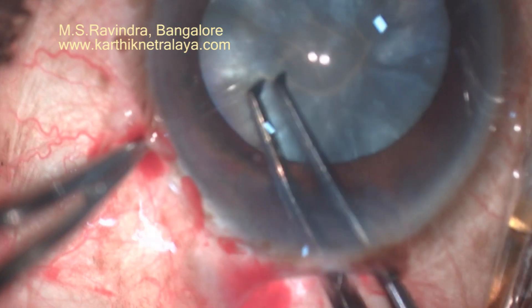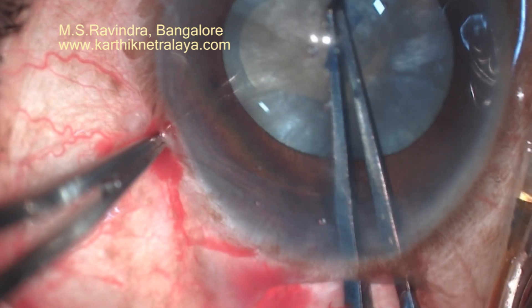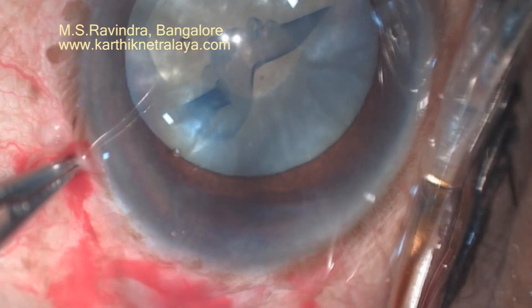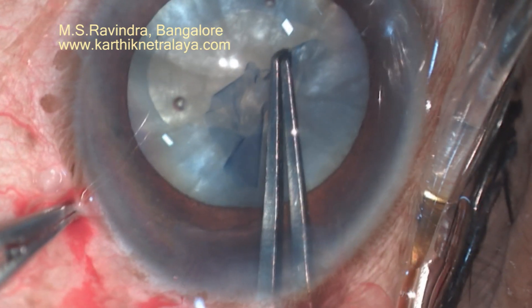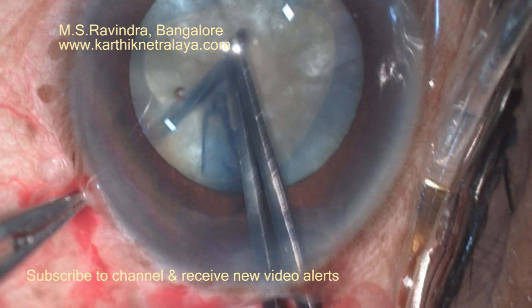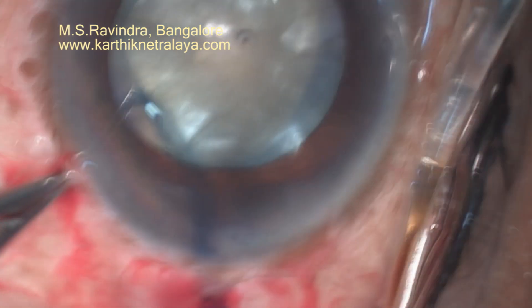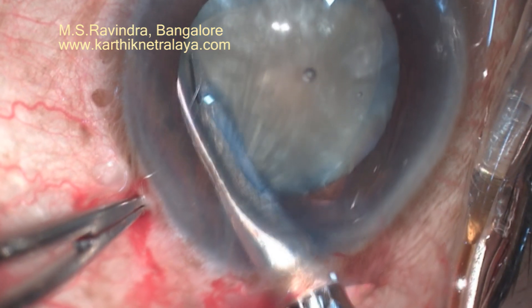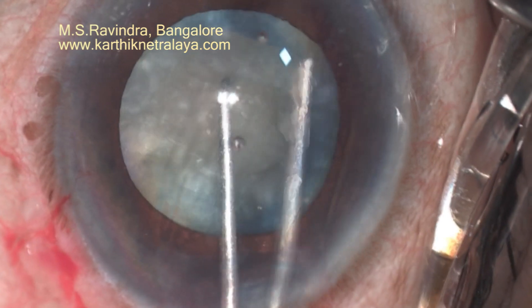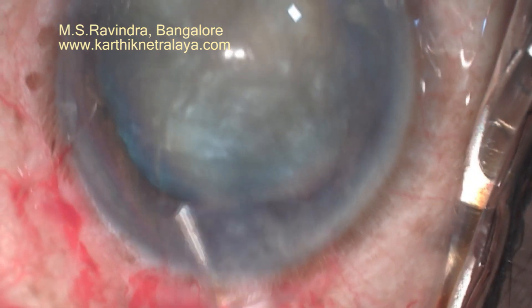Reform the chamber and catch hold of one end of the torn capsule, trying to maintain the integrity of the tearing capsule by mostly shearing and some tearing forces. Reform the chamber again — be very careful so it doesn't run off. At the far end it does run off to the periphery; I'm not going to pull it too much. Try to retrieve it — it's not happening, so just snip off the capsule with the Vannas scissors. The area where it has run to the periphery is a weaker zone; we will have to be cautious about that zone throughout the surgery.